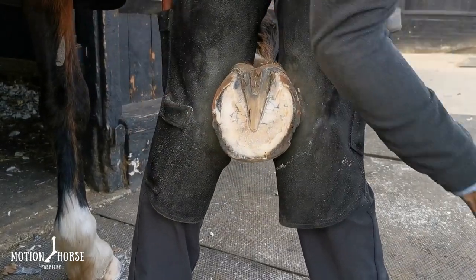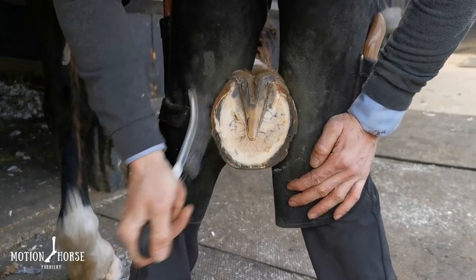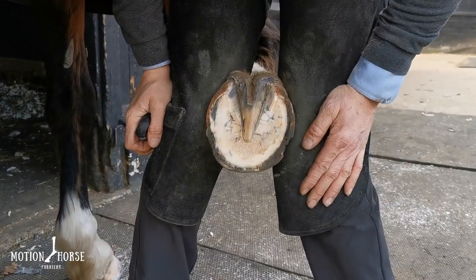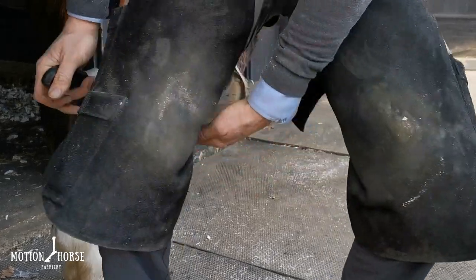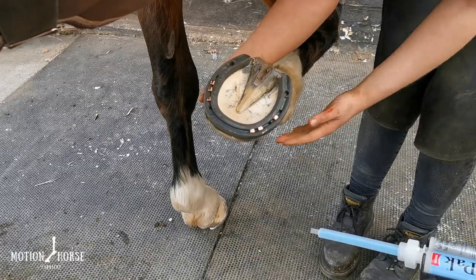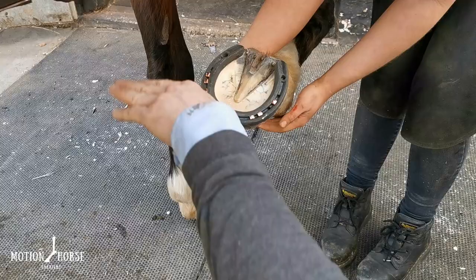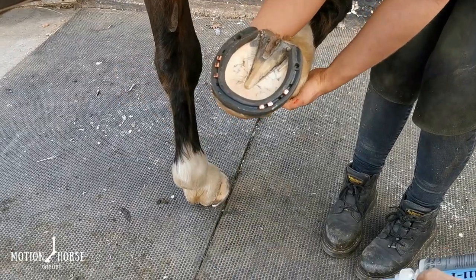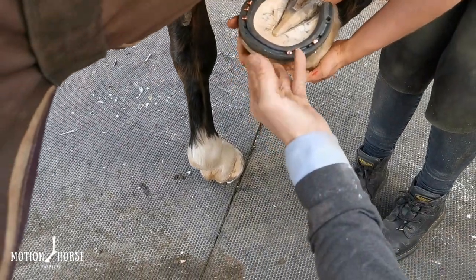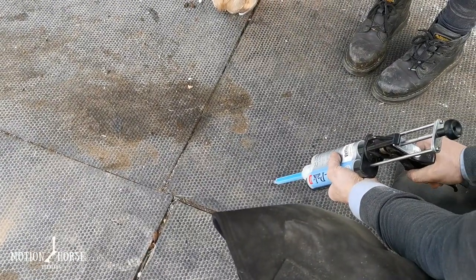So there we have it, ready to go. We're going to nail the shoe on, get the shoe finished off, and then apply the Vettec Equi-Pak. The shoe is now on the foot. We've got our Equi-Pak ready to go — we're going to purge a little bit of material out first, hold the foot nice and flat, and try to fill it nice and level. Fellow, if you can hold that foot as flat as you possibly can, I'll purge a little bit out.